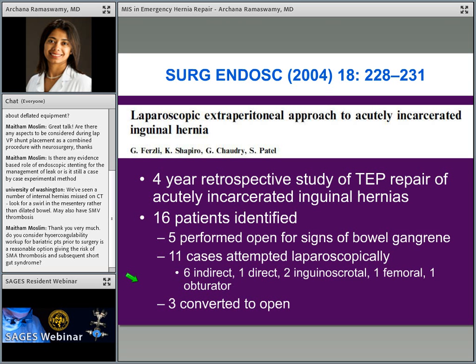Primary repair is always an option, especially if you have gross contamination. But there's definitely data that supports the use of lightweight mesh with light contamination. Biologic mesh, you know, it's there. It may get you out of jail if you think that you need it. And then coming back to this algorithm of ours, hopefully it seems like there's a little bit more data that supports it than when we started this talk.